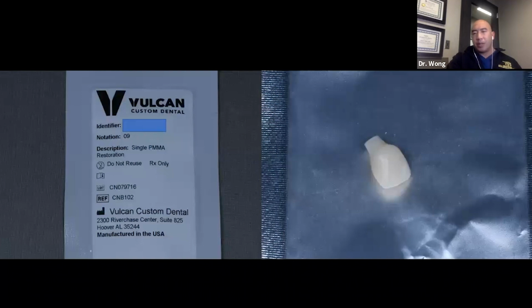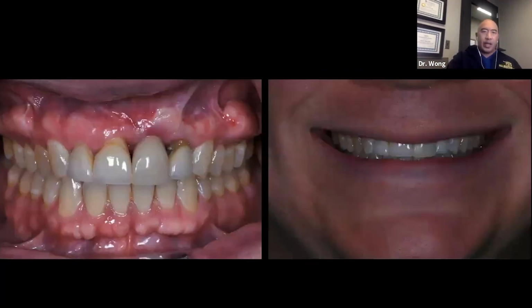So you can see the provisional is made with the critical zone of contour in mind, so that we just screw this thing in whenever we uncover the implant, and this is how he's going to heal. The reason he's going to heal like this in a provisional is because he's got other dental work that he's going to do. So we're going to get everything all restored at the same time.